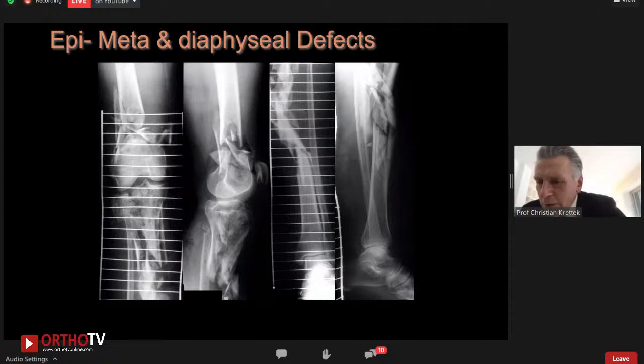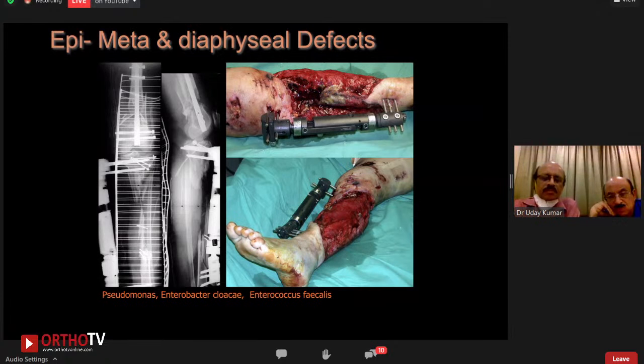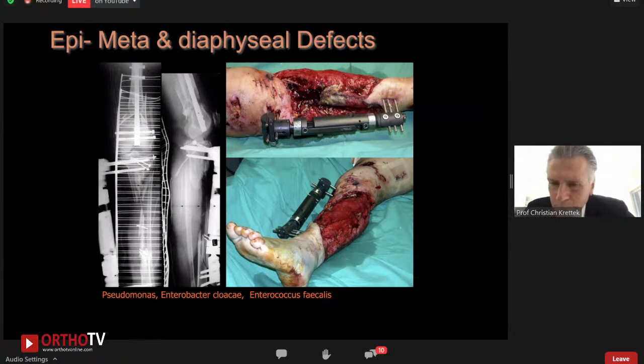Now with that, we also have good tools to address it. But they have done early fixation, and I show you how this looked like. And they have done a retrograde nail and external fixator in a joint preserving way. You see the large tibial bone defect. There is only minor bone defect on the femur. But the main problem, after a few days, you can see it from the wound. This is heavily contaminated. Yeah. And the surgeons went to the patient a second time and told her, we need to amputate this.